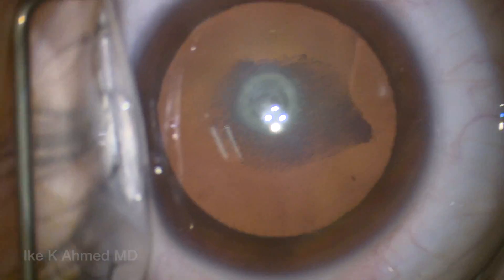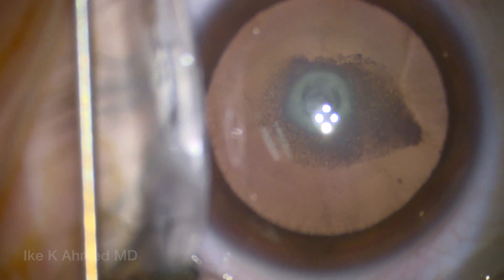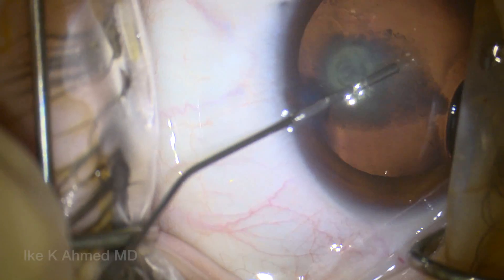It's a very interesting posterior polar cataract with residual hyaloid artery remnant material, which includes some stellate opacities on the anterior hyaloid, and with a posterior capsule that likely appears to be deficient.